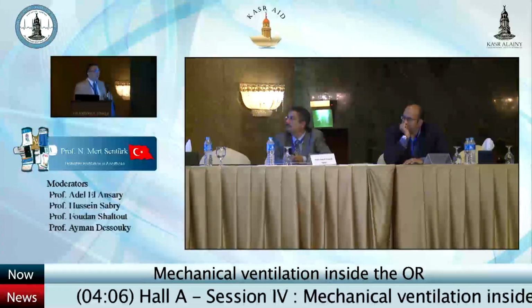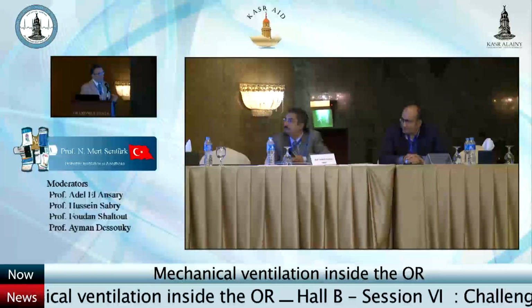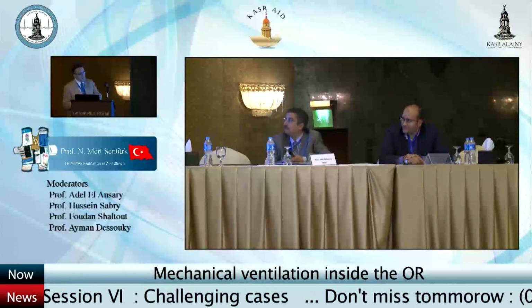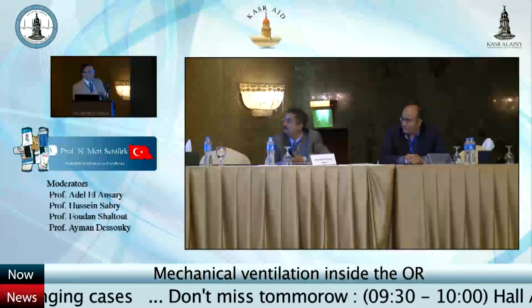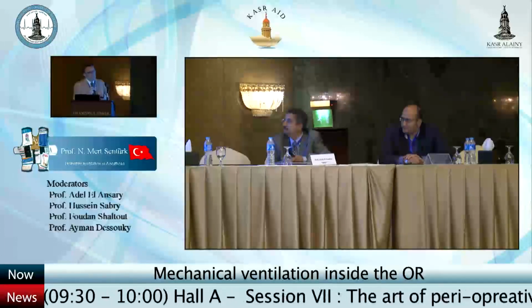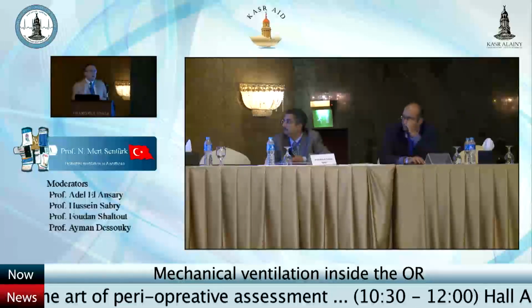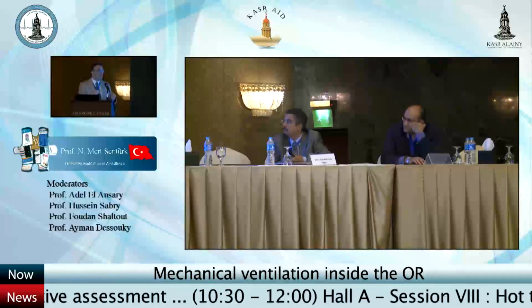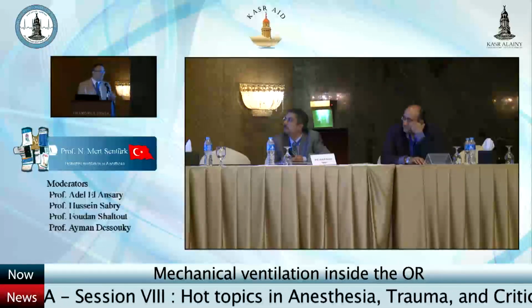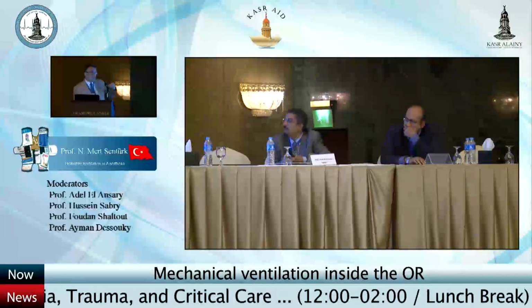Actually, we are now doing a study about it. It's not very easy to show the effects of low flow anesthesia directly in the protection of the lung. This is general knowledge, and I know this is not evidence-based, but we know that the higher the flow of the gas, the higher the damage in the mucociliary activity and clearance of the secretions, etc. But I have to say, it is not evidence-based.